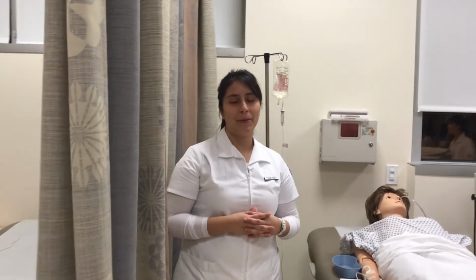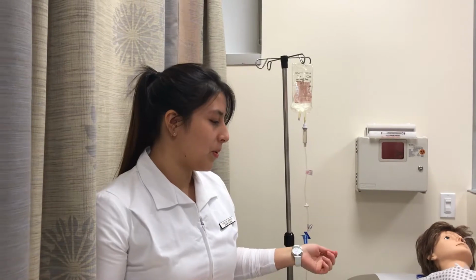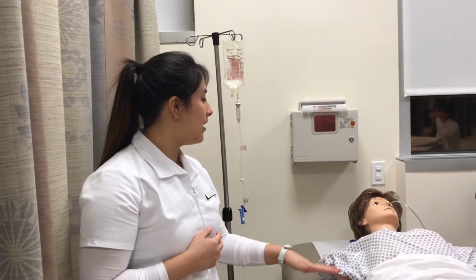Hi, my name is Joselyne Berreta, and I will be validating on setting up an IV piggyback. So first thing I'm going to do is my 7 steps. I will be checking physician's orders. I will be washing my hands, introducing myself to the patient, and identifying the patient.